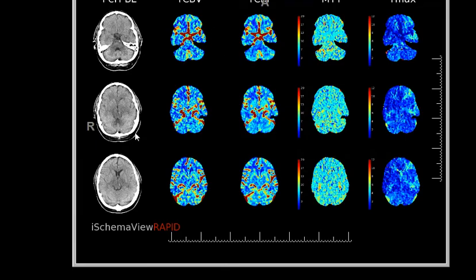We only covered 3 slices, so we didn't cover the stroke area. But that is the protocol set up by RapidAI. I complained to them that we didn't cover that much, and their chief investigator, Dr. Albert, agreed. So they are going to help us to increase the area of coverage. Maybe now it's become 4 slices instead of 3, but still pretty small. Just to let you guys know.